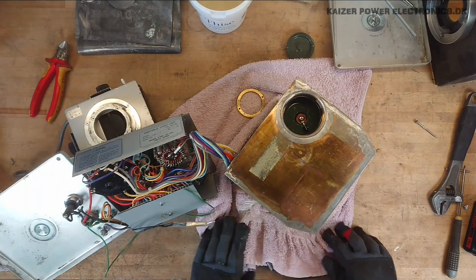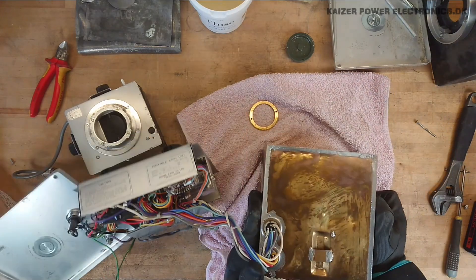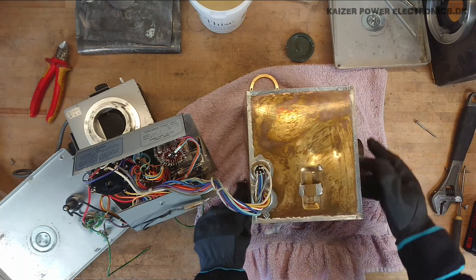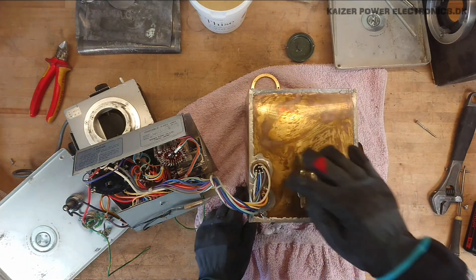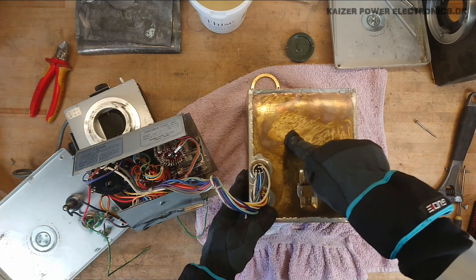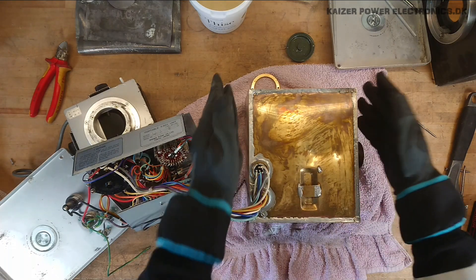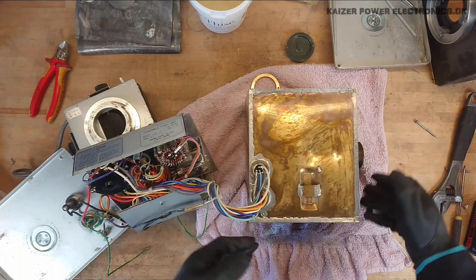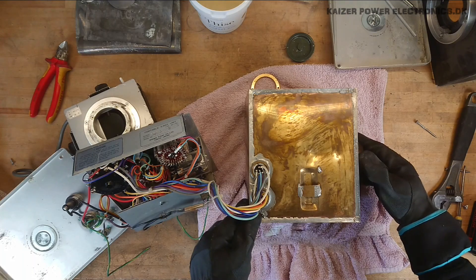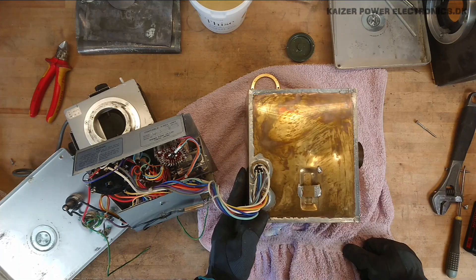I think my strategy for opening this up would be to either de-solder or pry it open all around here, which seems to have been the last place it was put together. De-soldering would probably take a lot of energy, as this is effectively one big heat sink. I'm not even sure my largest soldering iron can do this. But I'll give it a try. And if that fails, I'll just have to pry it open with a hammer.